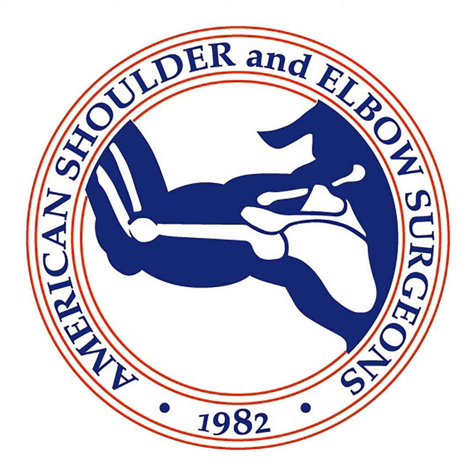And then I use a technique very similar to your partner, Bob Tajan, that he's published and has videos on. So I'll use tapes through the tendon, or really it's in the muscle belly more medially, and I'll tack it down in each corner, and then one anterior, one posterior, and then bring it to two lateral row anchors. So I try and cover the entire construct. And so it's independent tapes medially, anterior and posterior, and then to two lateral anchors.